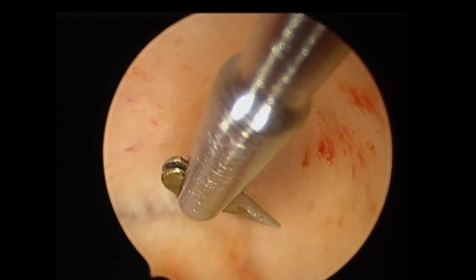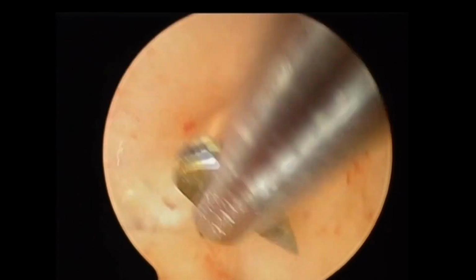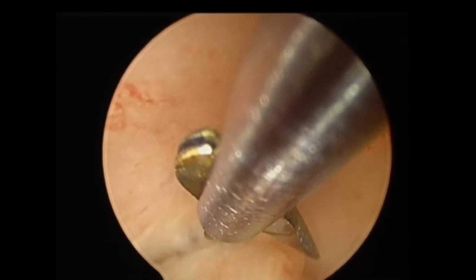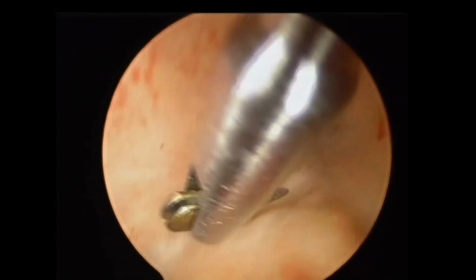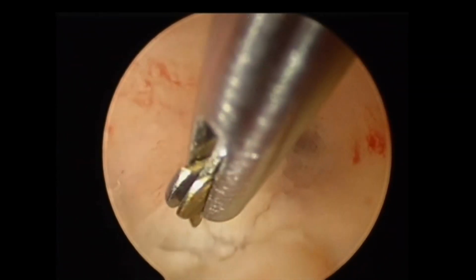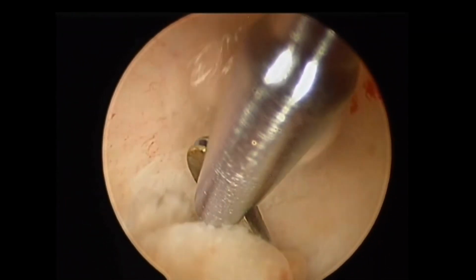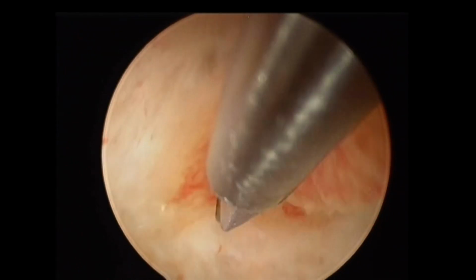Using the scissors in hysteroscopy requires training about how to rotate and use the blades not only to cut but, as you see here, to retract, okay? Because you cannot insert more than one instrument in hysteroscopy. So you need an instrument to cut and to push, another instrument to push the pathology to one side, so you can reach all the angles around the polyp. So again, rotating the blades, as you see here, it's a very nice trick.